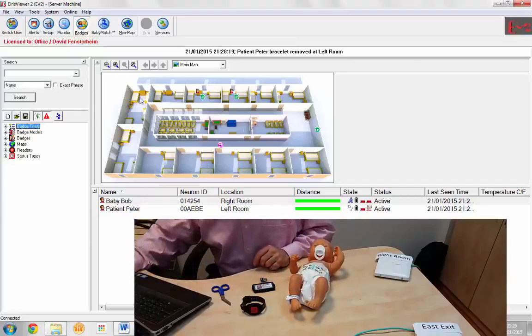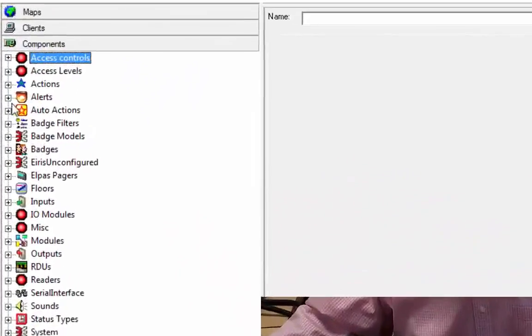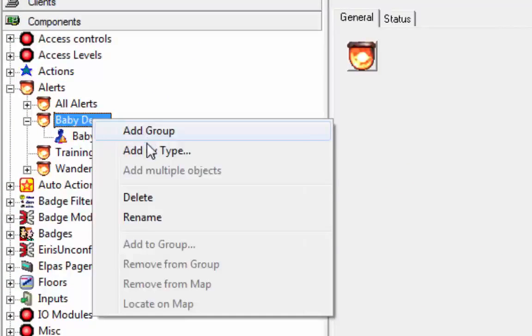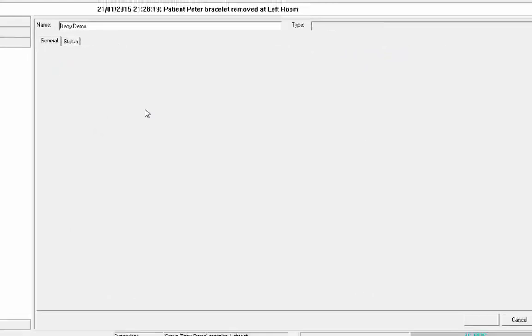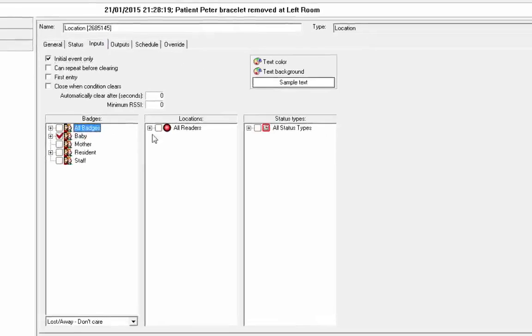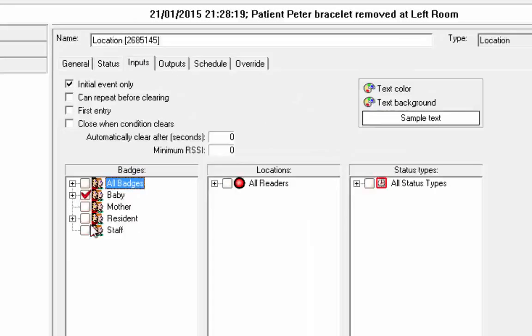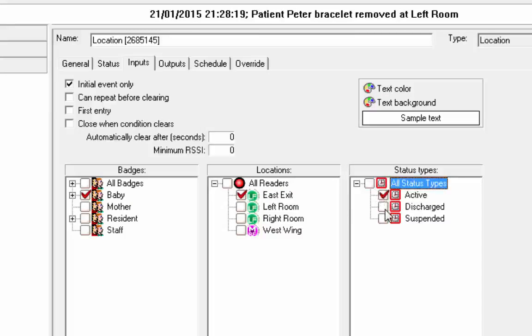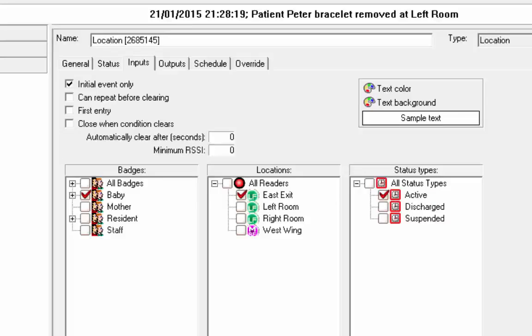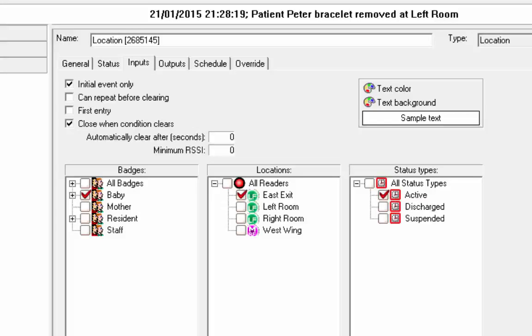Now we're going to define the exit alert for the infant. So let's go baby, add by type. Now we're going to do a location alert. And we're going to do that if a baby tag, you know what, let's do resident also. No. Stick with the baby. And if it reaches the east exit, and it is in the active status. Remember, if we suspend it, then we can remove it out and not trigger the exit alarm. What we're going to do is we're going to close when conditions clear so that it only triggers that immediately when it, if it leaves the exit, it'll close. You don't have to do that. It depends on whatever the customer requirements are for this system.